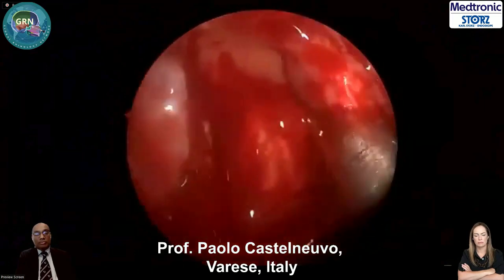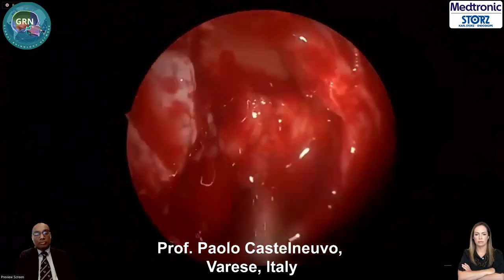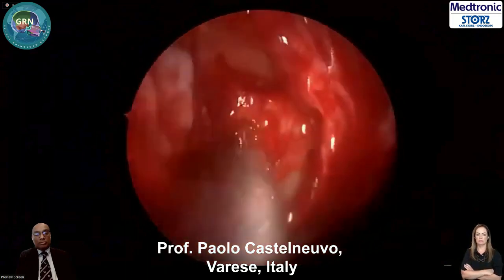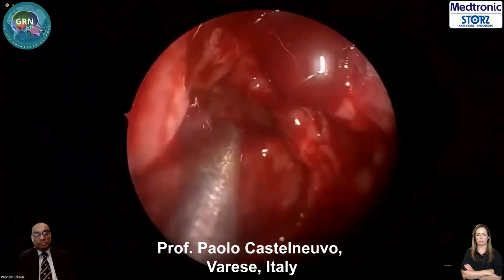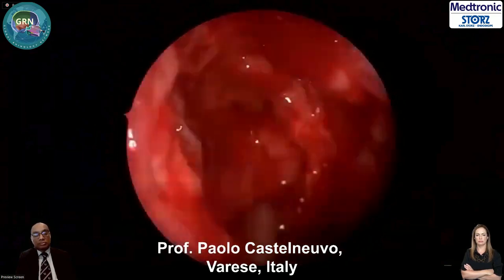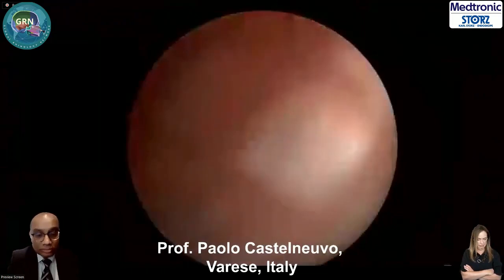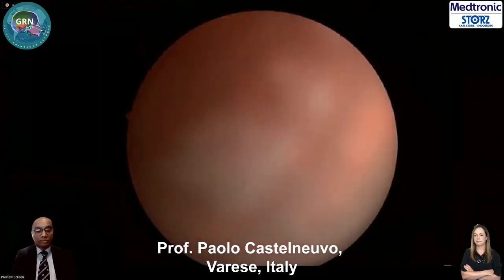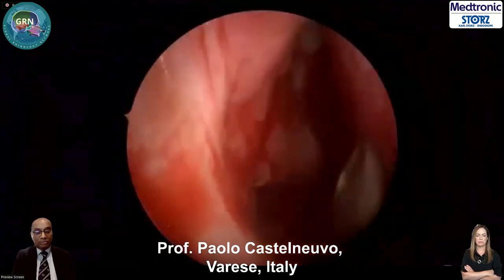The tumor was backing into the maxillary sinus, but no adherence in the posterior wall and then in the superior wall. So the pedicle you have seen on the CT scan should be anterior, close to the V2 nerve.